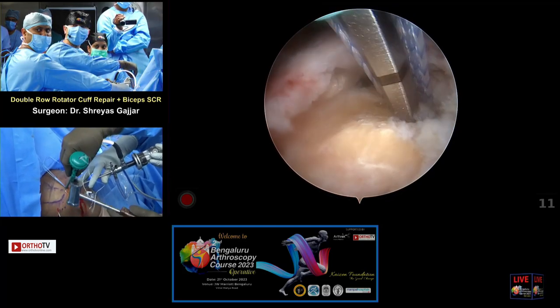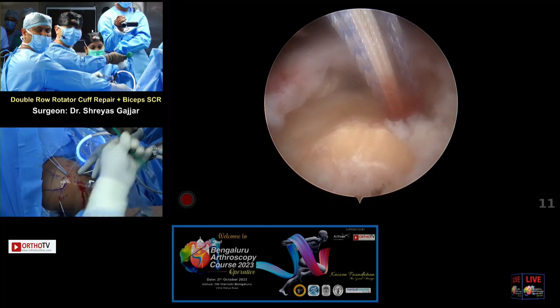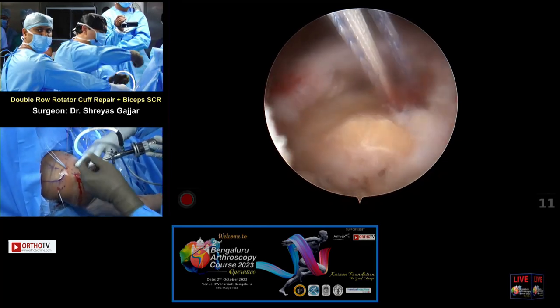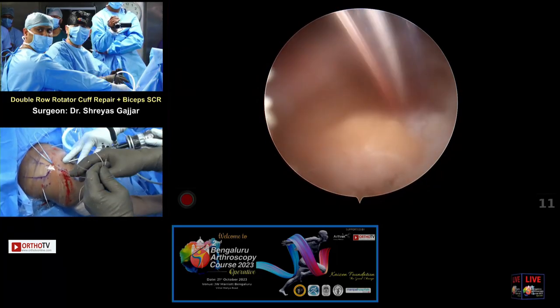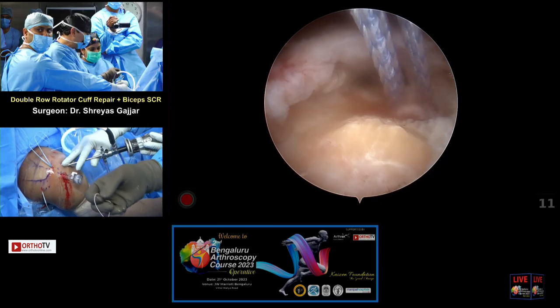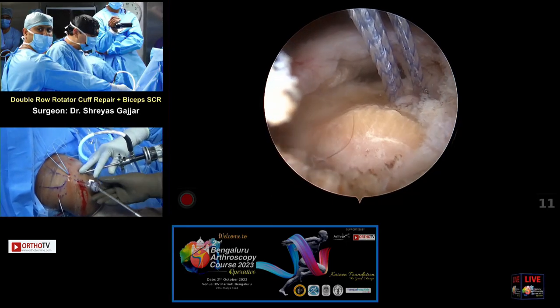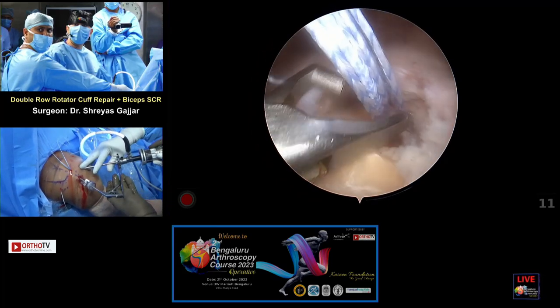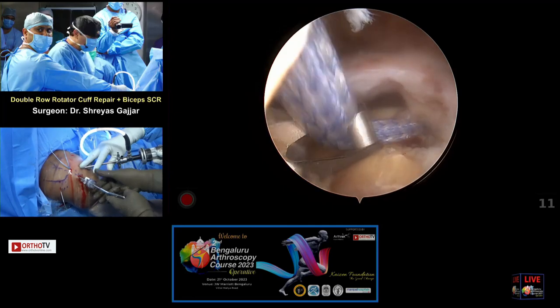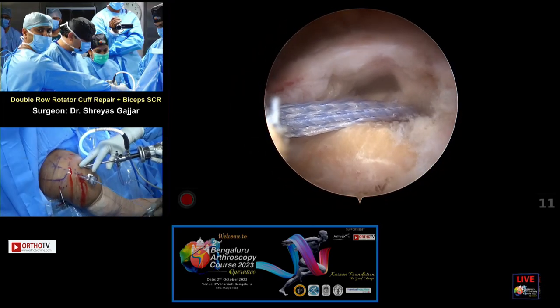When you are removing the thumb pad, keep an eye on that the anchor is not backing out. That's very important in soft bone, elderly patient. Now I remove this eyelet stitch because it's not a retracted tear, so I'm not going to use it to tie my sutures from anterior to posterior medially. Again, tape retriever, I'm getting the tape out. Scorpion needle, please. Akshay, can you hold this, please? Thank you.